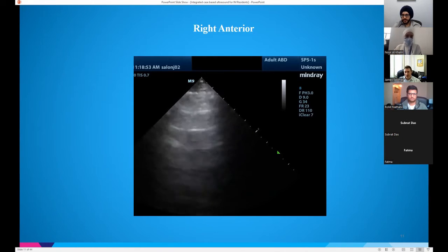Yeah, at least we can rule out interstitial and intraalveolar processes like pneumonia or pulmonary edema or hemorrhage as a cause for his symptoms. Okay, at that point, right? Always remember, whenever you're doing ultrasound, especially in the lungs, you can rule something out at that particular point. It's just an ultrasound beam in one area. So I agree with you here. I don't see any B lines.